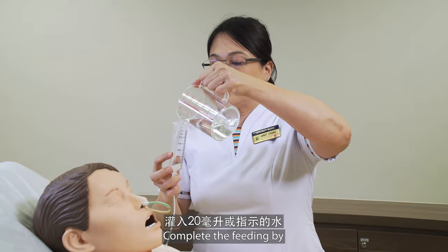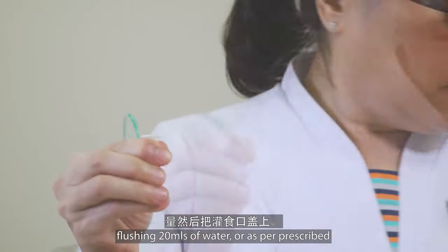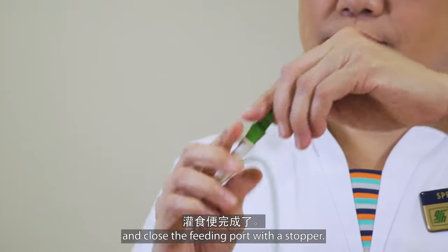Complete the feeding by flushing 20 ml of water or as per prescribed, and close the feeding port with a stopper.